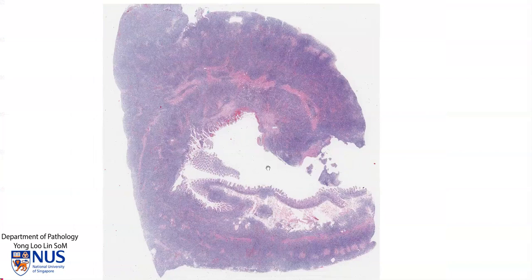In summary, this is an example of a MALT lymphoma, which is a type of marginal zone lymphoma affecting the small bowel. We have sheets of lymphocytes composed of a mixed population of small, medium-sized, and larger lymphocytes. There is no evidence of transformation into an aggressive large B-cell lymphoma. We also have an area of ulceration of the mucosa, which may potentially lead to GI bleeding. Thank you.